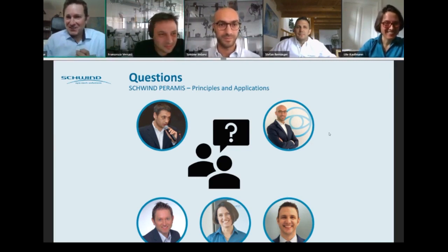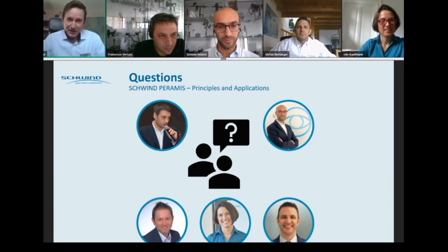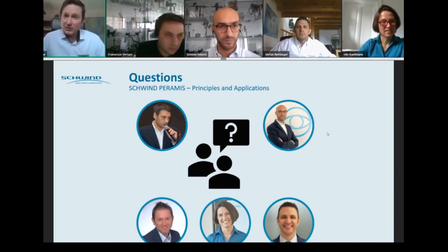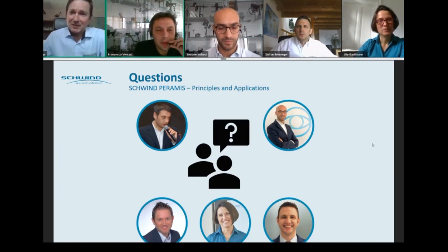Basically, of course, there's a way to select aberrations, but not inside the Peramis. You can play around with it there, but if you really want to treat selective aberrations, you would do that inside the SCHWIND CAM software. And maybe I can already announce that we are currently planning another webinar, with the topic of customized treatments. So this might be following up on these questions you were having.